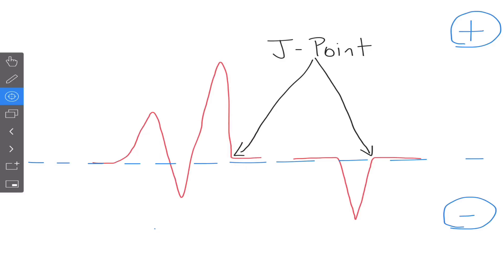With a left bundle branch block, you're going to almost always have a negative deflection before the J point. So with a left bundle branch block, what we're really seeing is a general direction of the current moving away from V1. So you might remember that each of the leads on a 12-lead EKG are camera views. Well, for V1, the electrical current in the heart is moving away from that camera. Thus we see the negative current movement.